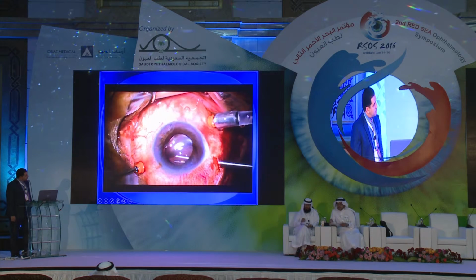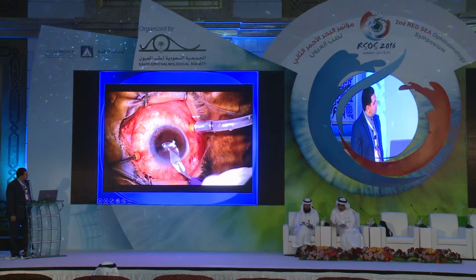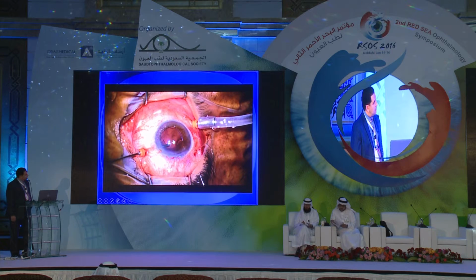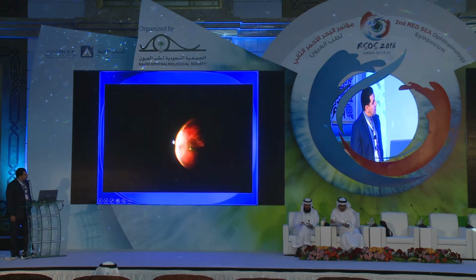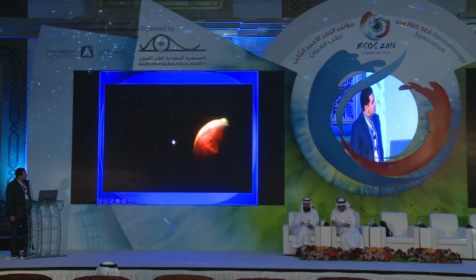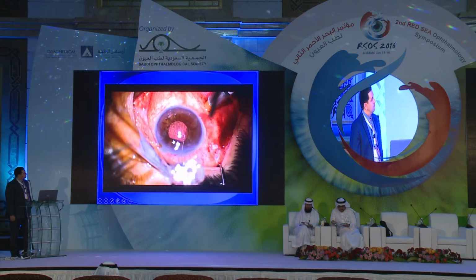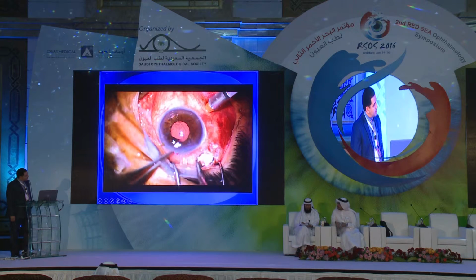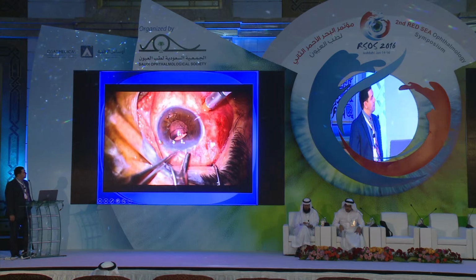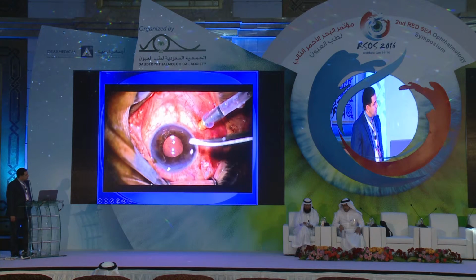Now I try to bring it into the anterior chamber. Bring it out already. Now I am examining the peripheral retina, very cautiously, because this is the area where the lens was stuck. I searched for any small hole, anything. Now I will implant an Artisan again, but it will be a posterior Artisan, retrofixating. Fix it already, and then I will take sutures.